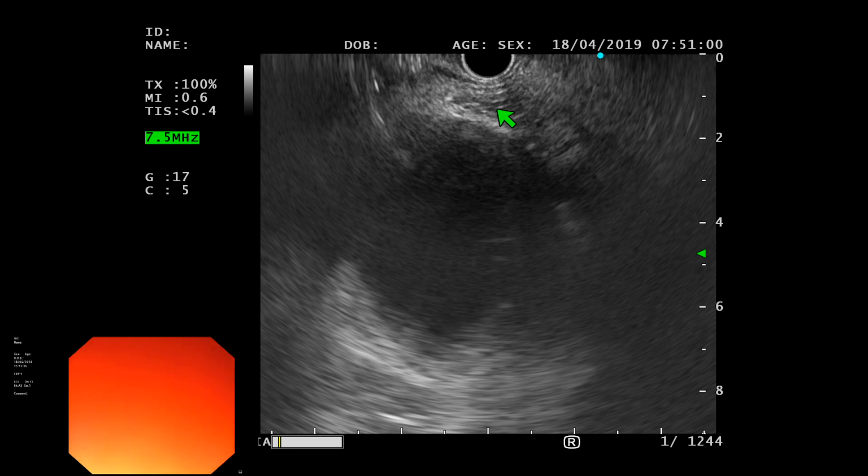If it's 4 centimeters, and if it's 6 centimeters, does it mean that we are seeing till 6 centimeters, or that the same image is bigger, or that we are seeing more structures down? You're zooming out, right? As you go down, you're zooming out, so you'll see more, but everything will look smaller.